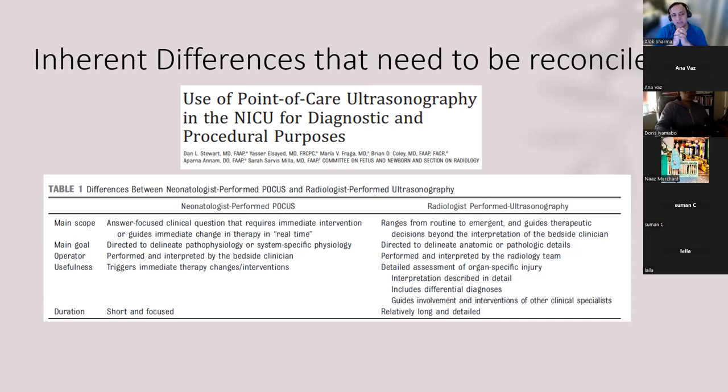And the reason I'm presenting this is because if you're implementing this in your local institute, I would say that if you've not spoken to the radiologists, then you're missing out. And the reason you're missing out is because there are certain conditions of the lung that need further imaging, that might need referral. There are clearly situations where we will find something that we can't recognize. And actually having that overview or oversight, and I would say that ability for them to be able to come back and say, look, I've had a look at it as well, and I don't know what it is. Let's get a CT. Or I've done a chest X-ray and a lung ultrasound, and I don't know what it is. Having that communication basically medico-legally for you keeps you safe.